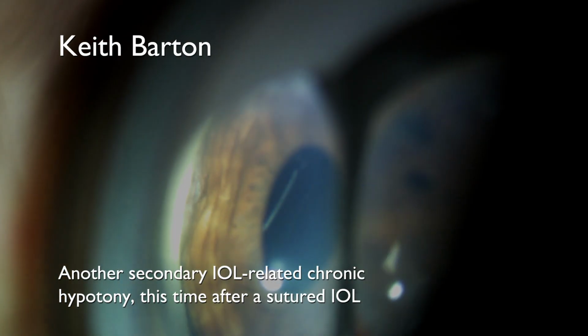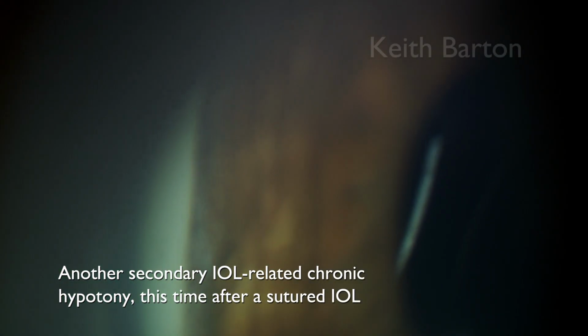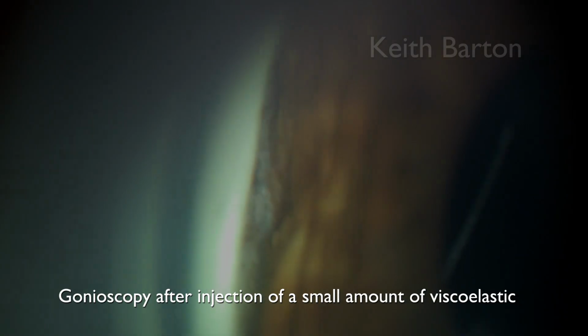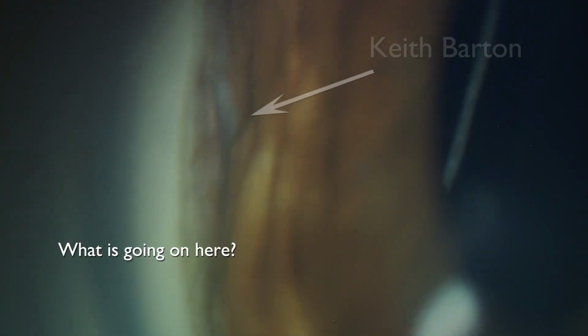This is another secondary IOL-related chronic hypotony case, this time after a sutured IOL. On gonioscopy after injection of a small amount of viscoelastic. What is going on here?